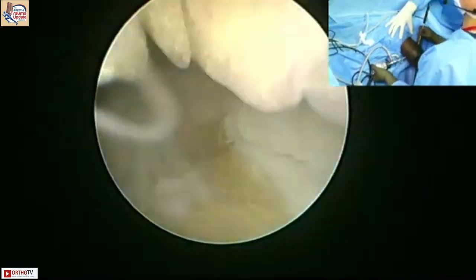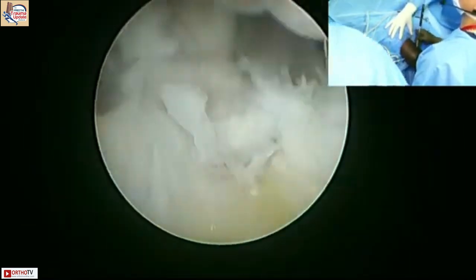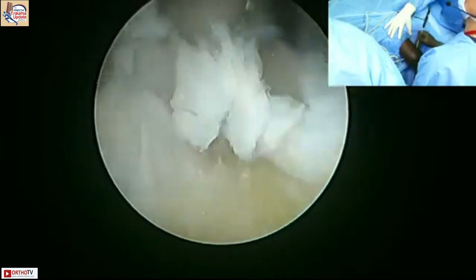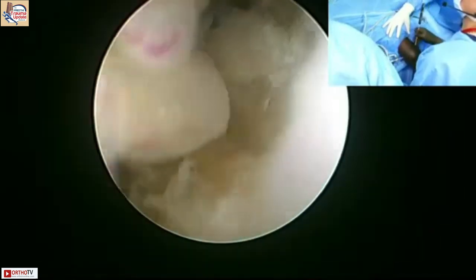Sir, how do you do the capsular release? Usually with the periosteal elevator or shaver? So I do both. You never use the RF for it, right? I try not to use RF in the elbow, because there's a risk of chondrolysis.